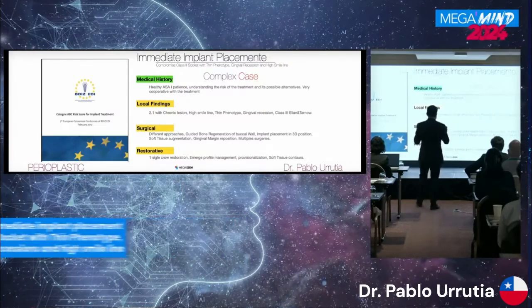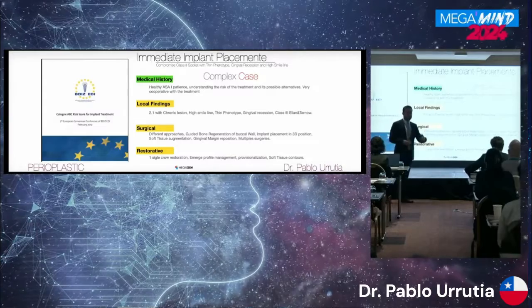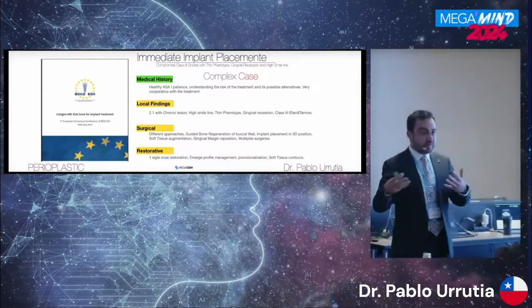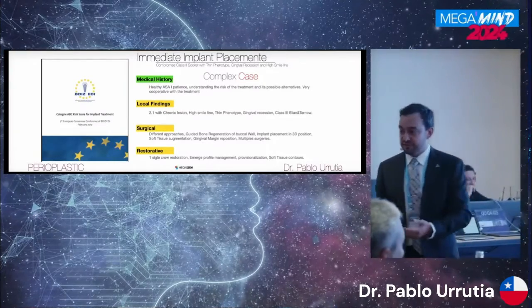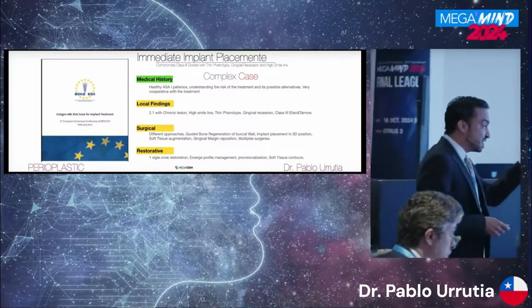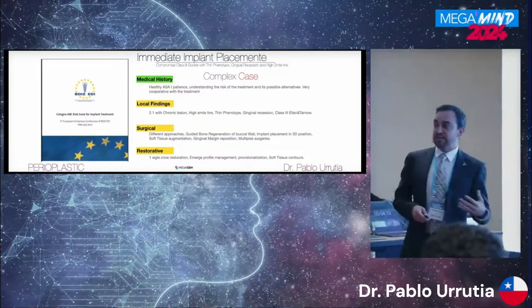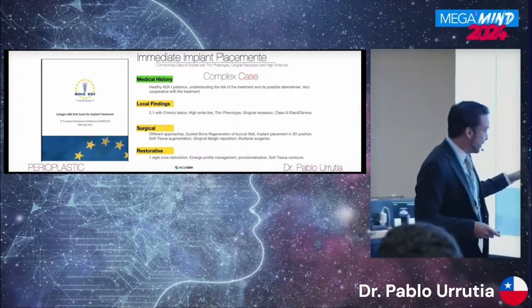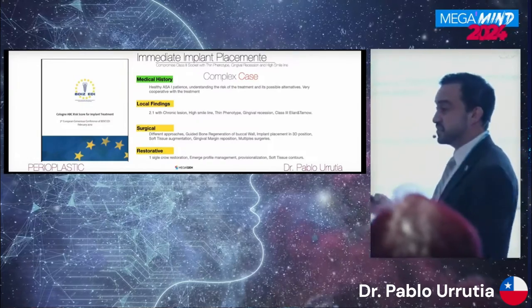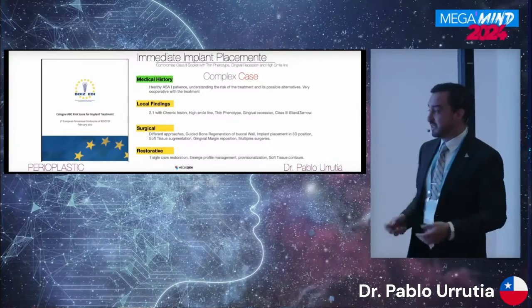Every surgeon has his rules about the time, his expertise, the risk management, okay? The younger are maybe more prone to take more risk, but the other one maybe has more experience or has more of a staged approach in that kind of situation, okay? But we need to face the GBR, restore the bone wall, and place the implant in a 3D position to have the soft tissue in proper thickness and gingival margin position. Multiple surgeries could be faced in that case.